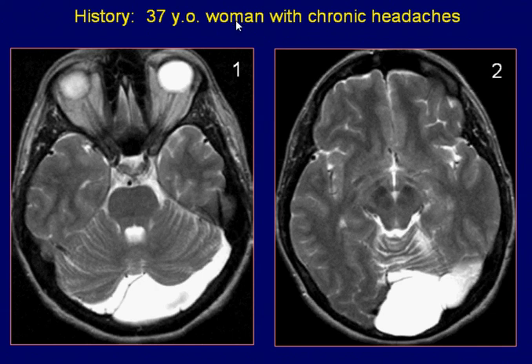A 37-year-old woman with chronic headaches. Axial T2-weighted images of the brain demonstrate a well-defined hyperintense area behind the cerebellum. The lesion is of similar signal intensity to CSF.